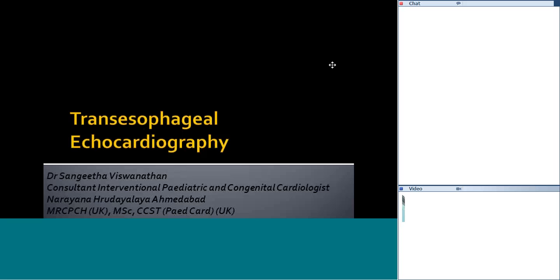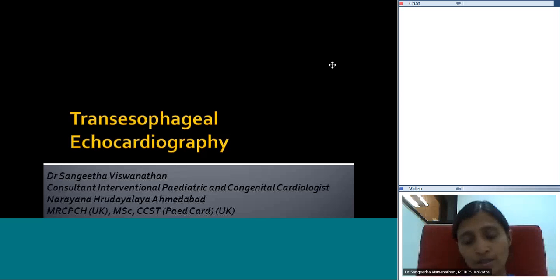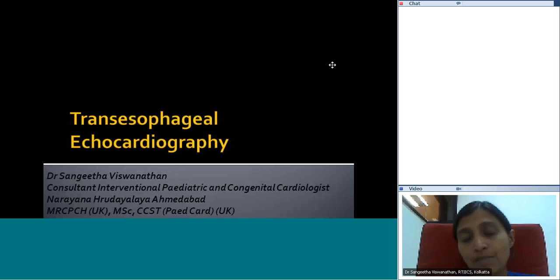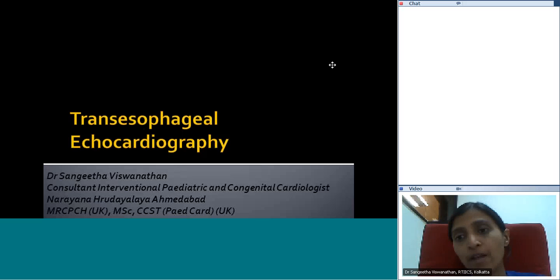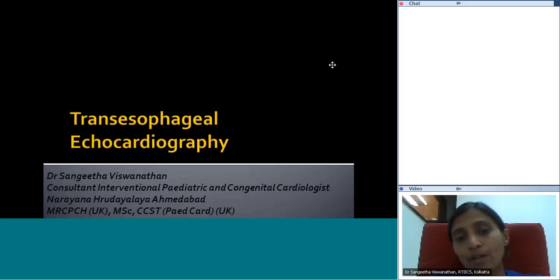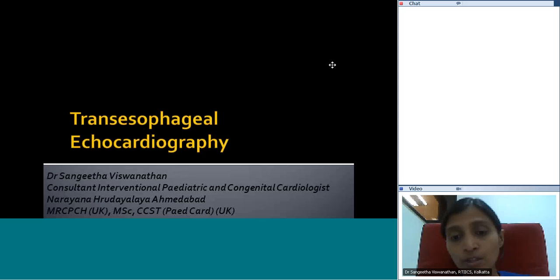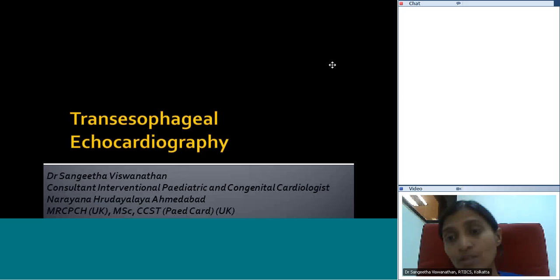Good evening everybody, it's nice to see you again. Today we'll try and go through some of the basic practical aspects of transesophageal echocardiography. I will aim to mainly look at the various views that we use in TEE to look at the various cardiac structures, focusing on normality rather than pathology. This is targeting people who are just starting TEE to make them familiar with the process and the basic views to view the heart.